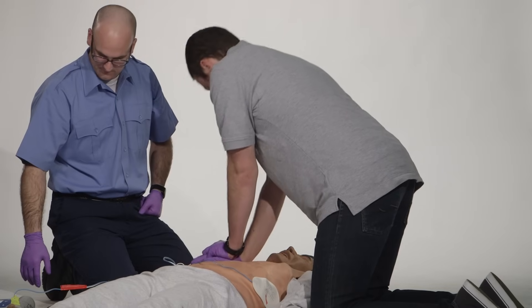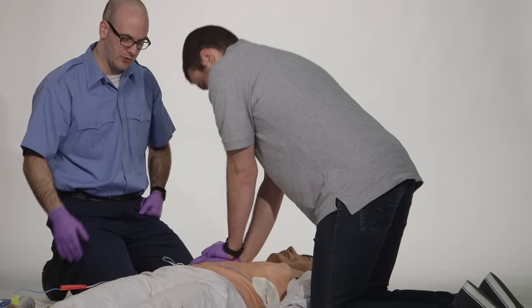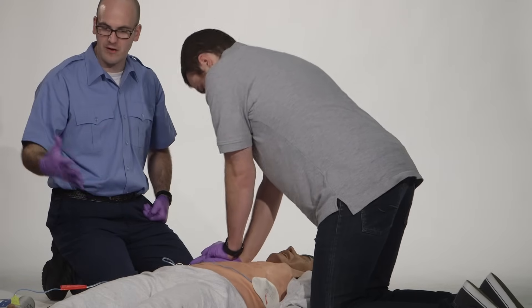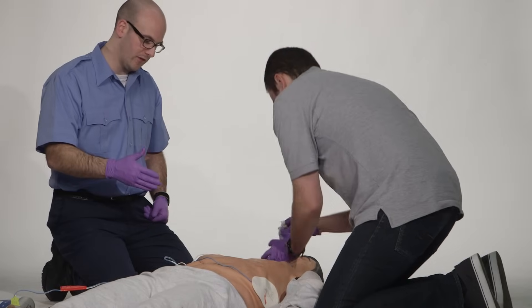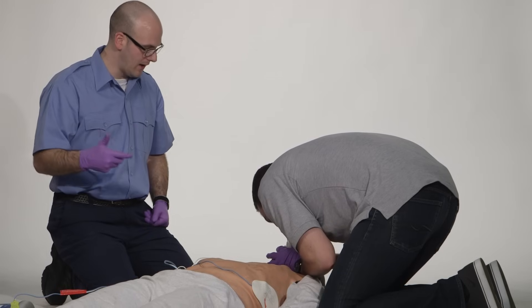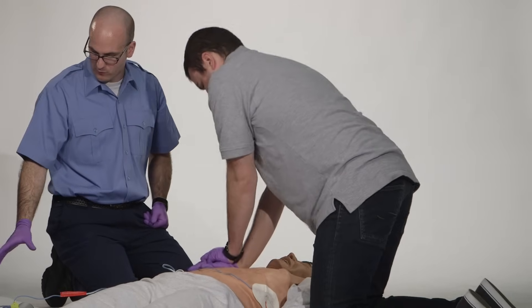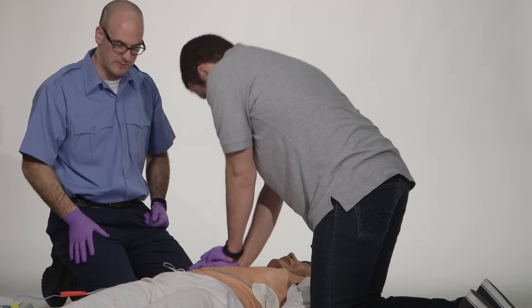If needed, begin CPR — so we'll continue CPR. We'll do another cycle of CPR: two minutes or five cycles. Assuring adequate rate, adequate depth, and chest recoil. Then we'll reassess whether we need to shock again and reanalyze.